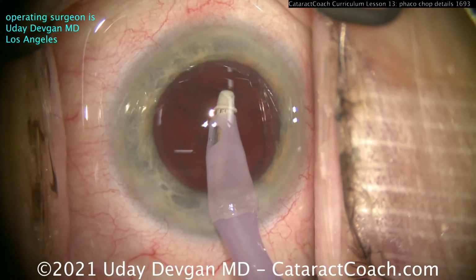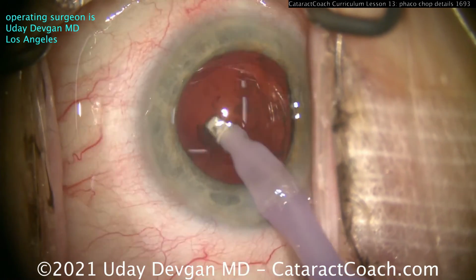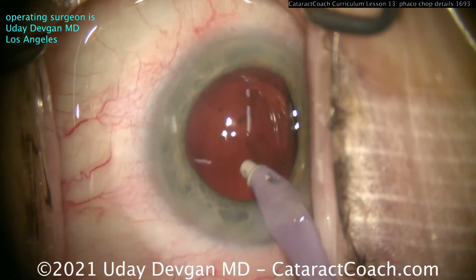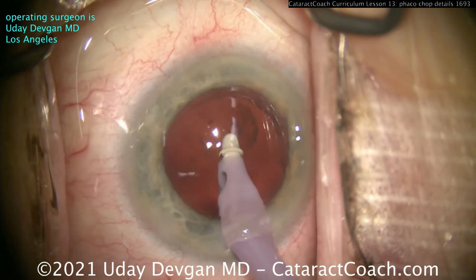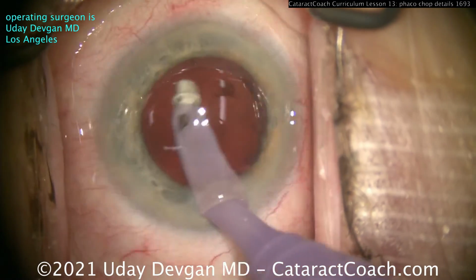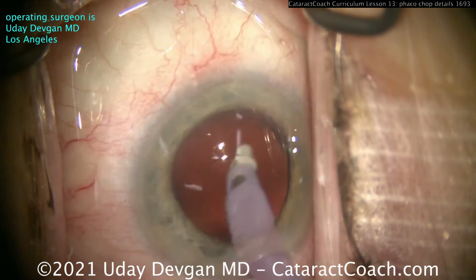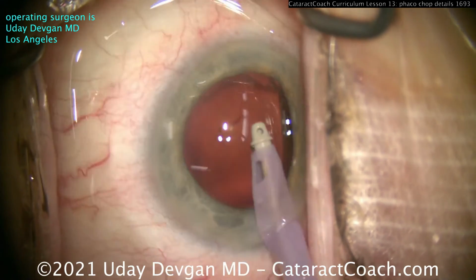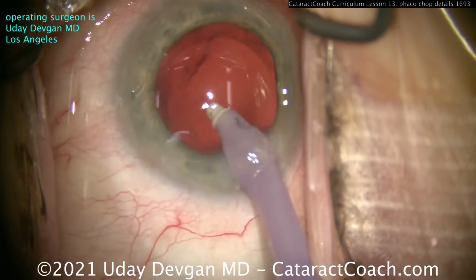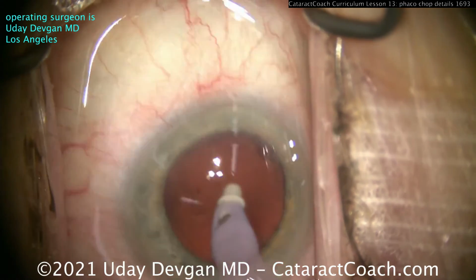So we have the initial chop to break it into 2 heminuclear pieces. The first heminuclear piece was broken up into 4 smaller subpieces. The second piece was broken up into maybe 2 or 3 small pieces. So a total there of 6, 7, 8 chops, which is very typical. So it's much easier to work with smaller pieces if you have a higher nuclear density. And we can still keep the total energy placed in the eye very low. This patient's still going to have an absolutely clear cornea on post-op day 1.